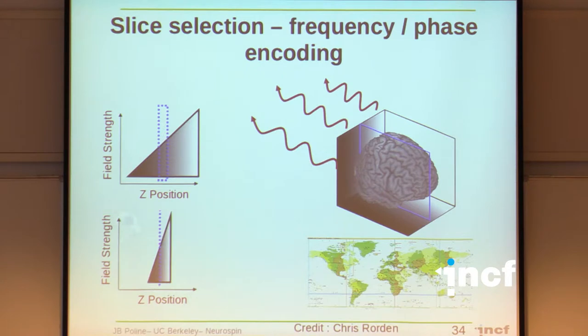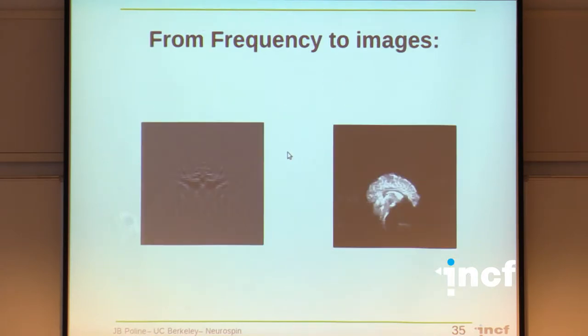And that's just an illustration of what I said. You've got high frequencies on the right of the brain, low frequencies on the left of the brain, you're measuring that, and then you're taking the Fourier transform, and that's it. That's the actual recording that you get from a slice in an MRI, and you're taking the inverse Fourier transform. What you're looking at is the actual frequency magnitude. So these are the low frequencies, like the shape of the brain, things like that. And on the outside, you've got the high frequencies, which give you the details. Again, you've got tools that are going to be super useful.